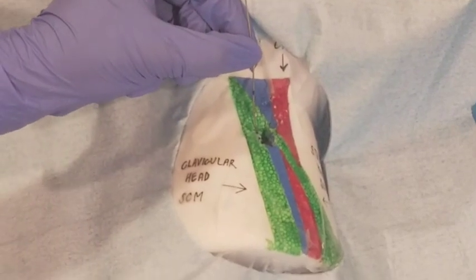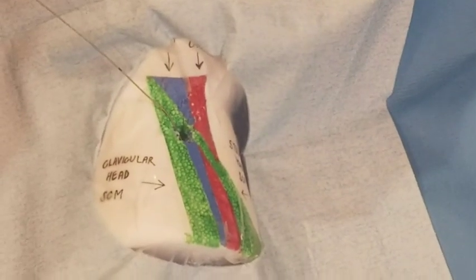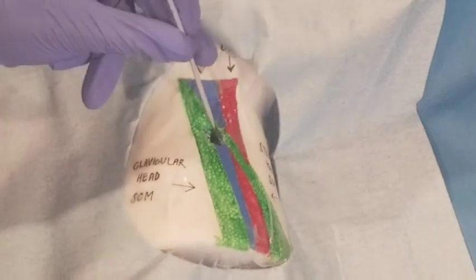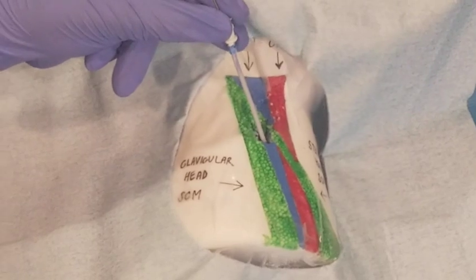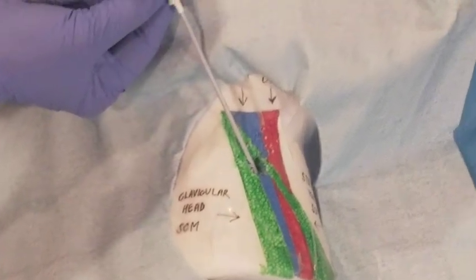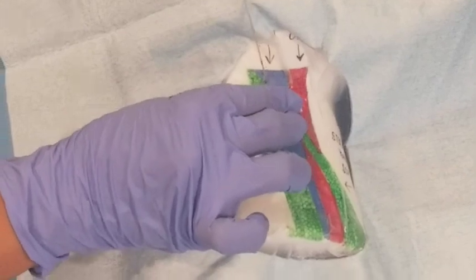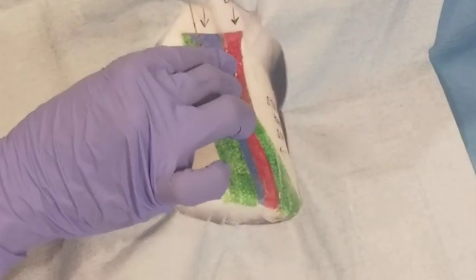Now we're going to introduce our dilator over the wire. This is going to deepen our insertion track so that the catheter can be moved through the vein. Okay, we just need to insert the dilator up to 3 to 4 centimeters, and then while holding on to the wire, you want to remove the dilator, always holding on to the wire. Now it's time to insert our triple lumen catheter.